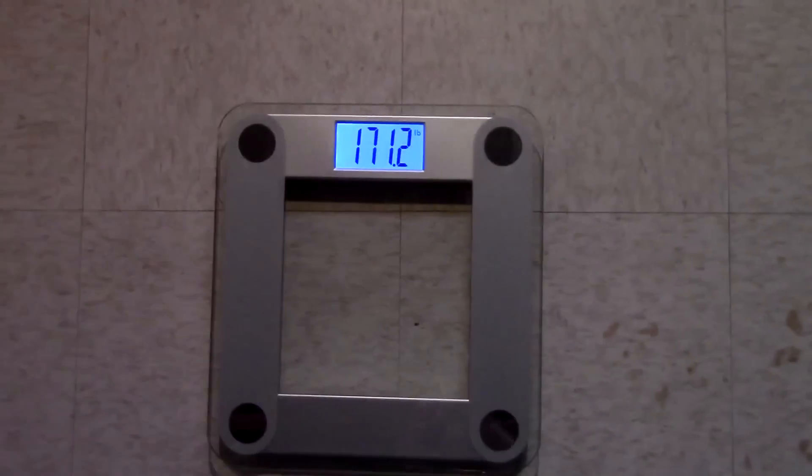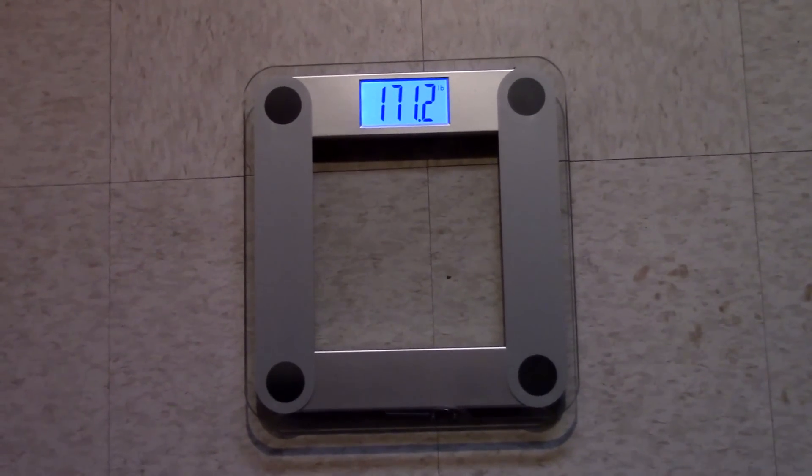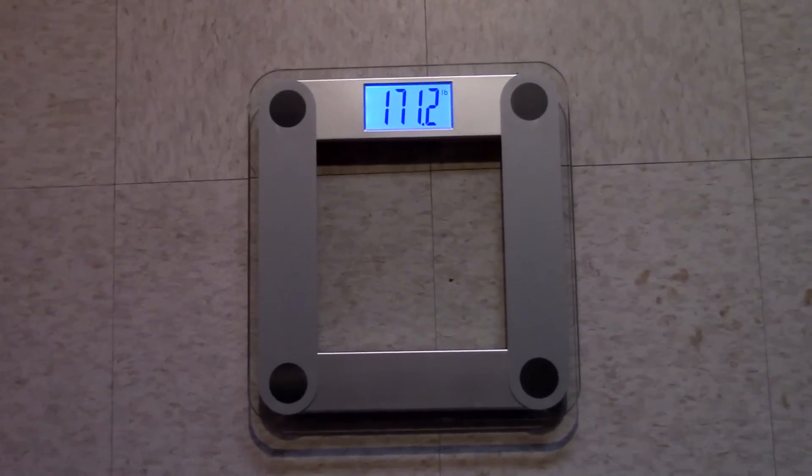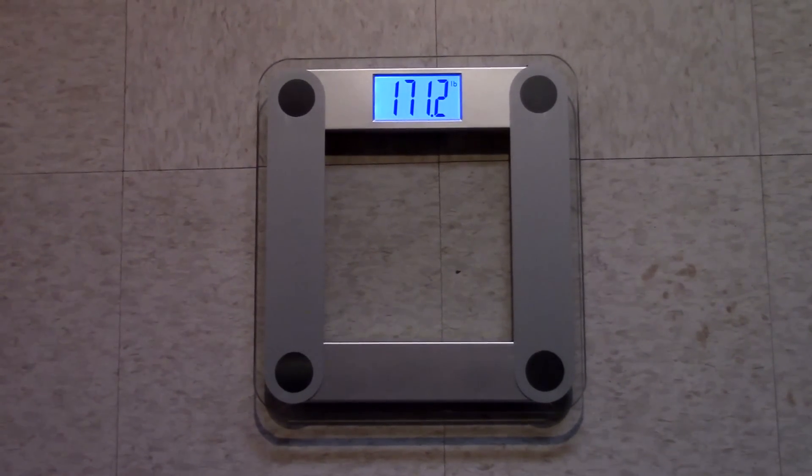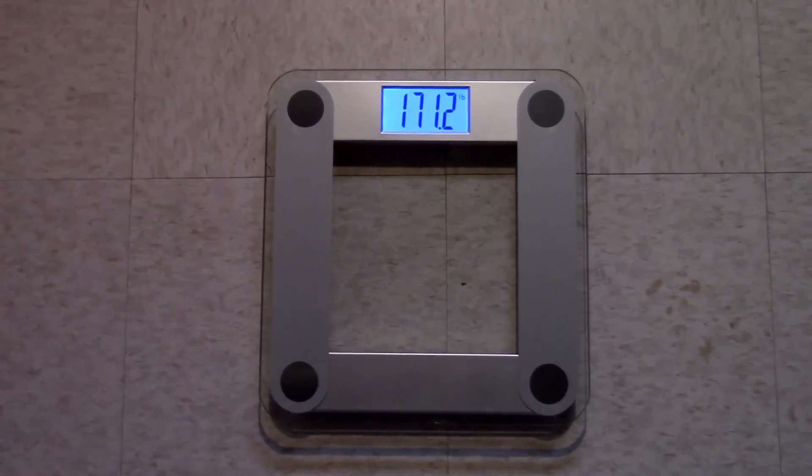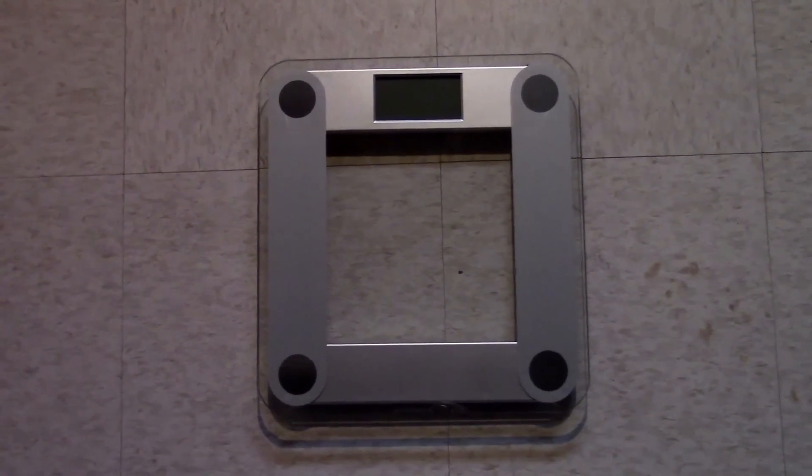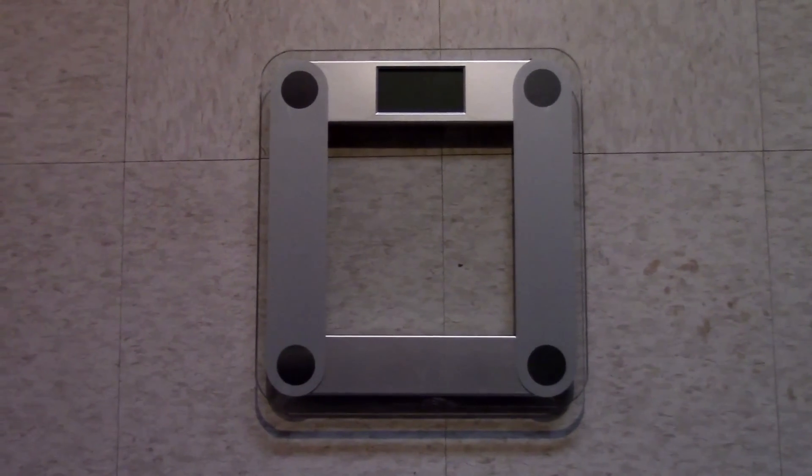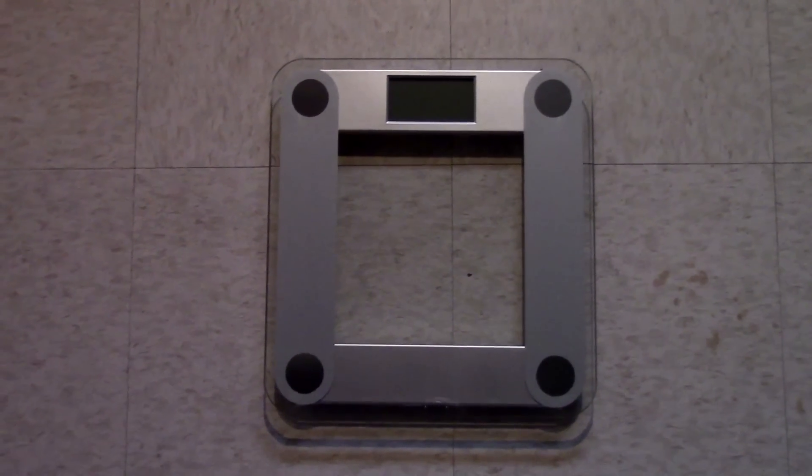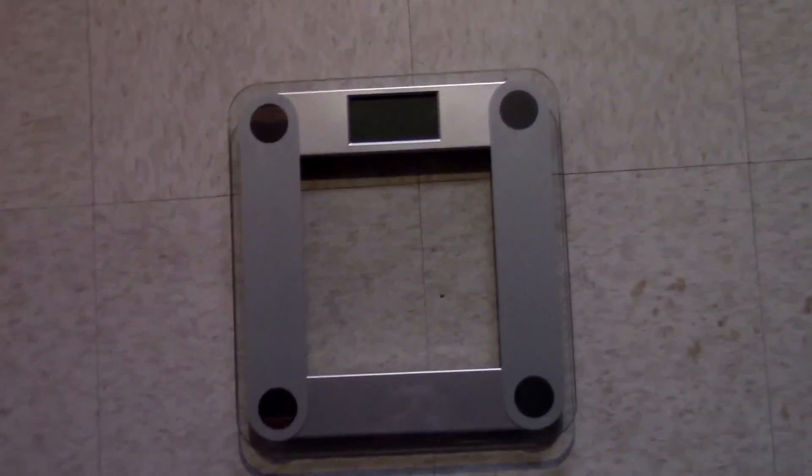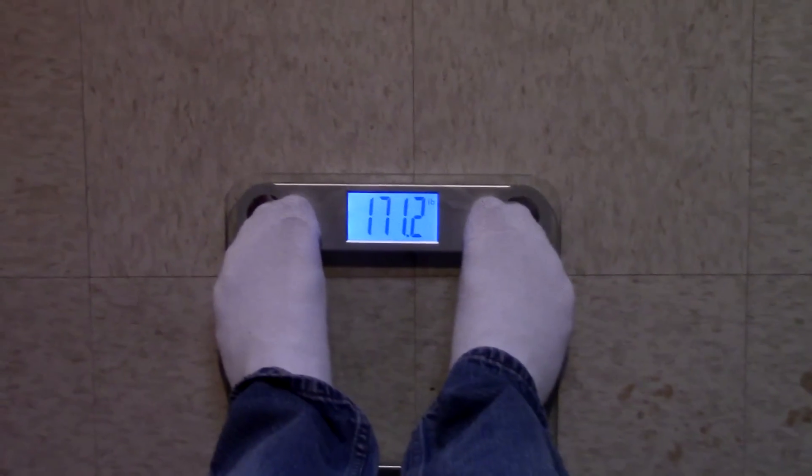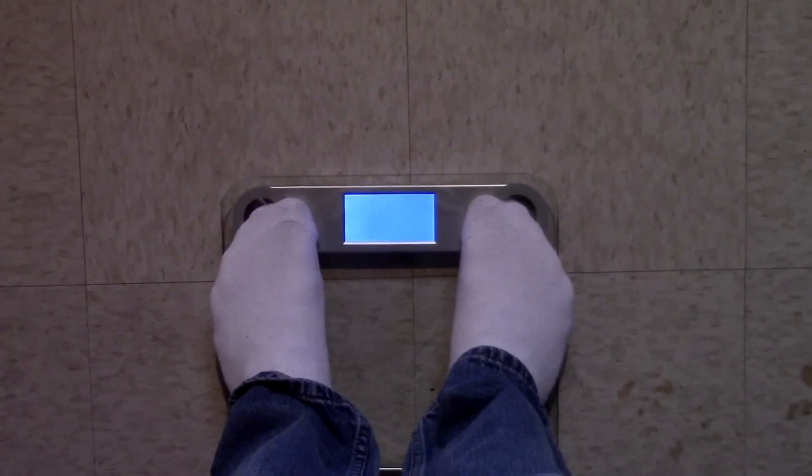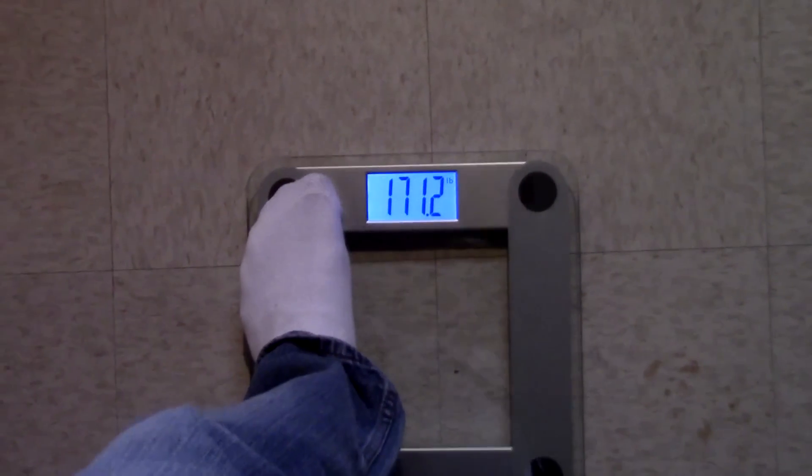Let me go ahead and step off of it again. Let's go ahead and let it reset. And the reason why I'm doing this is because the scale does seem fairly accurate when you compare it to other models that are around a similar price, which is ideal here. Obviously, if you want a scale, you want it to be accurate. 171.2. Excellent.